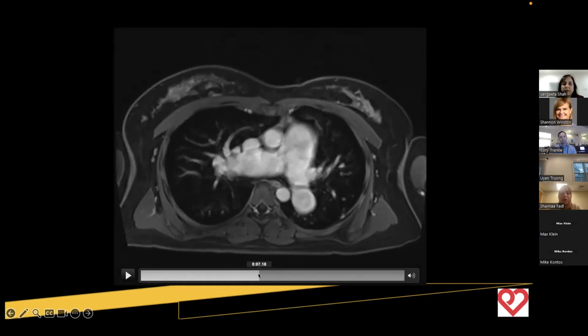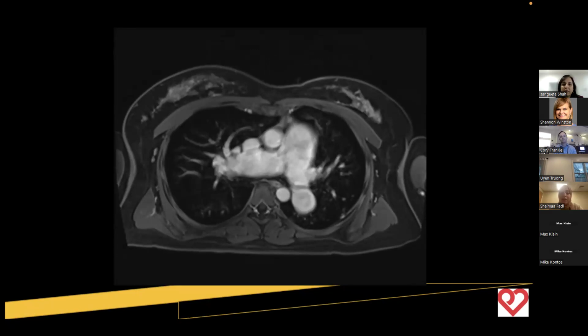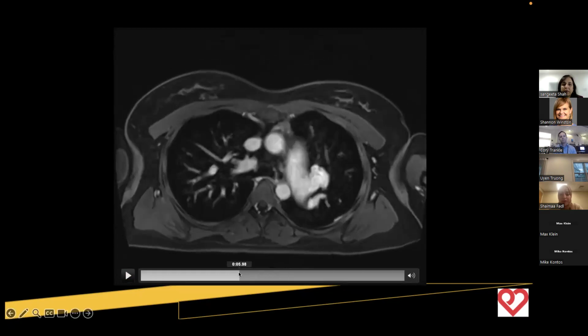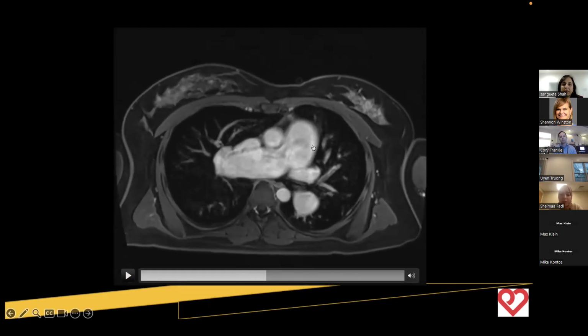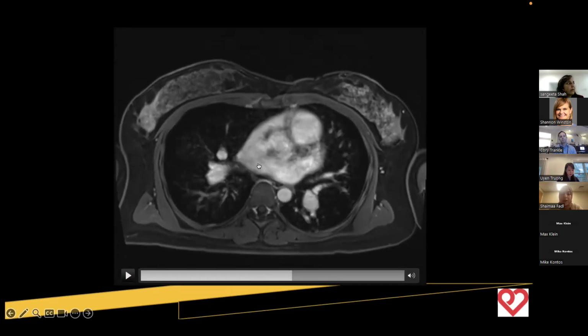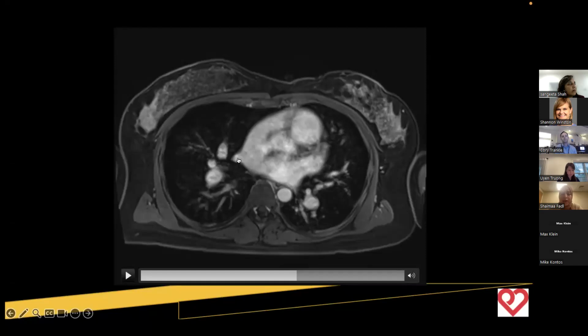Scrolling inferiorly, you will start to see at that level significant dilation of the pulmonary arteries, particularly the main pulmonary artery when you compare it to the ascending aorta. At the same level, you can see anomalous venous drainage from the right lung to the SVC. Going more inferiorly, this is the interatrial communication site, and going more inferiorly, you can appreciate that anomalous vein coming from the right middle lobe and inserting into the location of that interatrial communication.